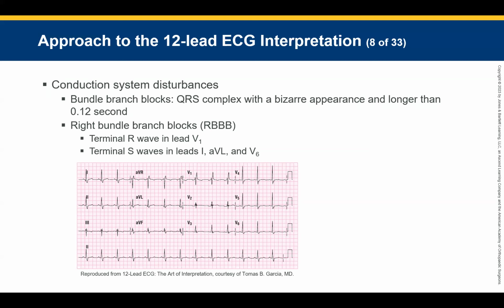We're in a normal sinus rhythm. That's what we're seeing on lead 2. Guys, I need you to know some 12 leads print off like this, and I love this. This is what I prefer. You have your snapshot. 1, 2, and 3 is a 3-second snapshot. aVR, aVL, and aVF is a 3-second snapshot in line. So first 3 seconds, start of the next 3 seconds, start of the next, going across time. We're getting 3-second snapshots across time.